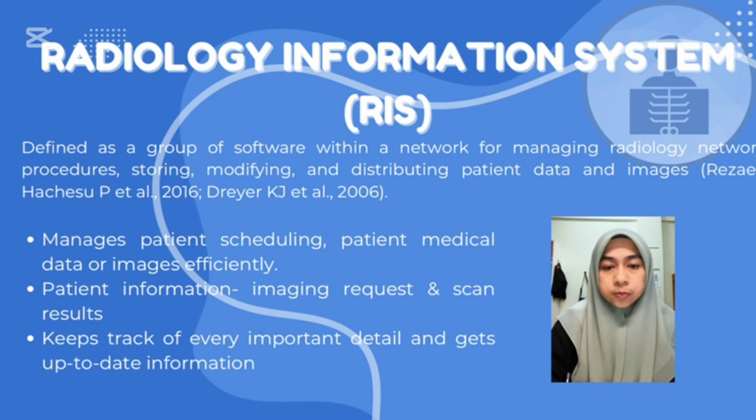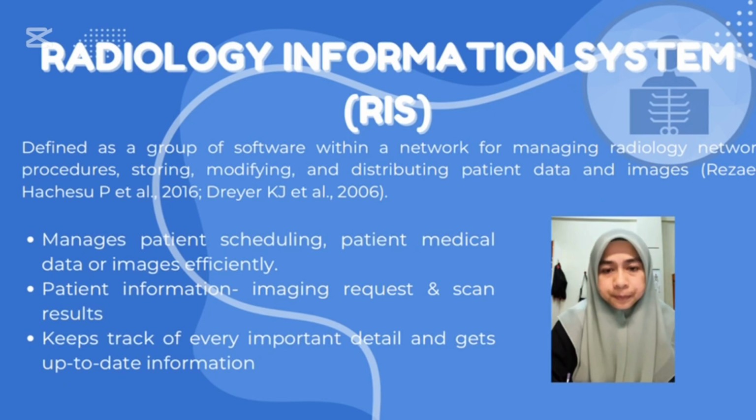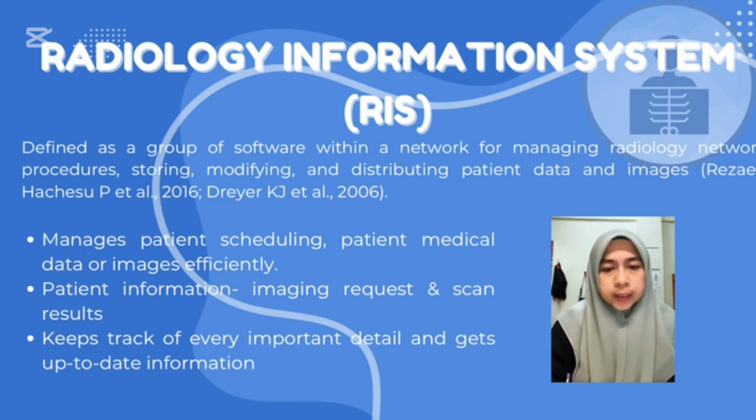Okay, how the system works is, first, it helps to manage patient scheduling, patient medical data, and images efficiently. It can track where and when the procedure needs to be done for the patient. It also keeps records of patient imaging requests and scan results.